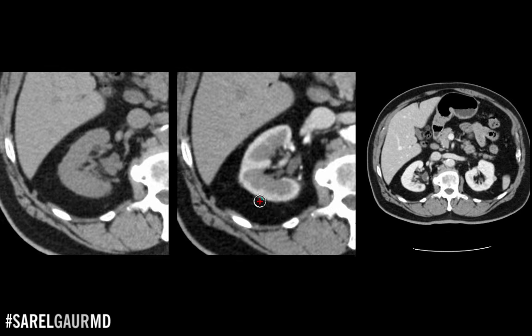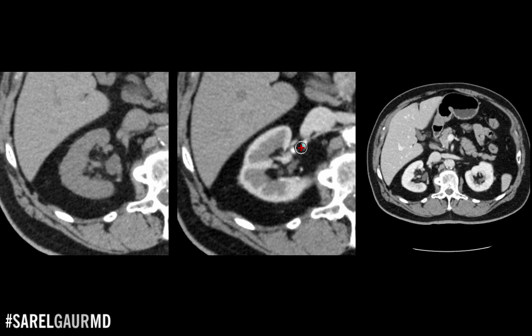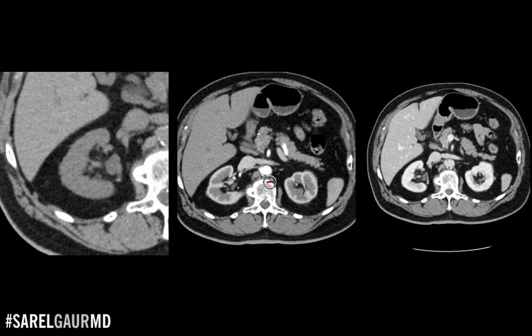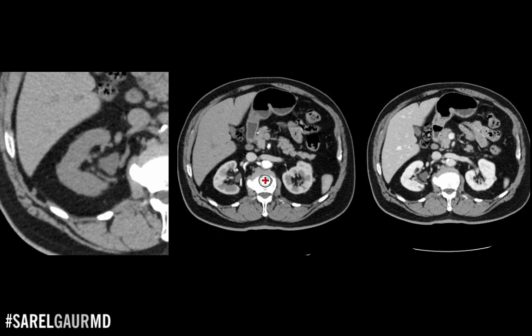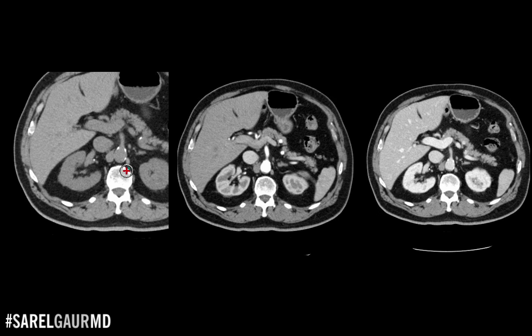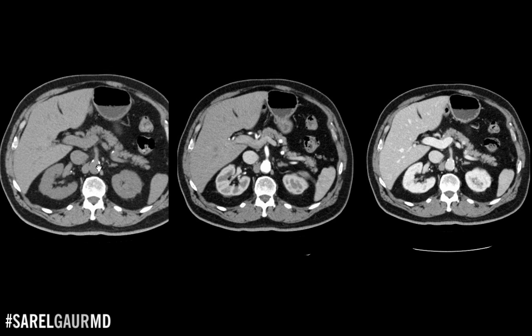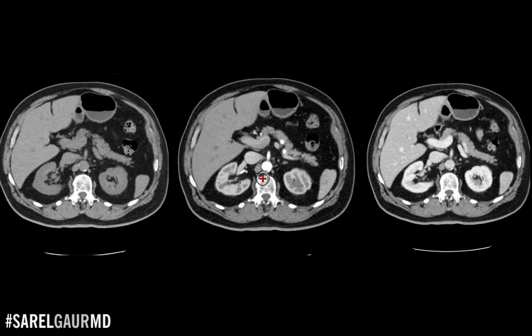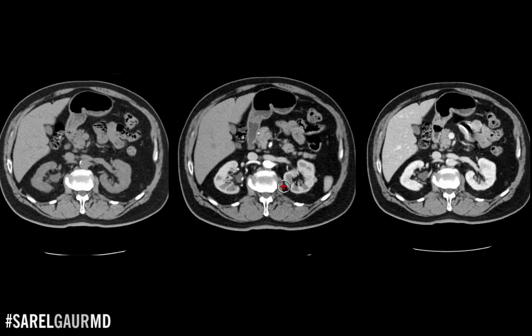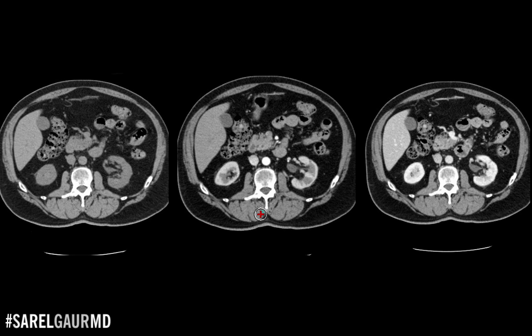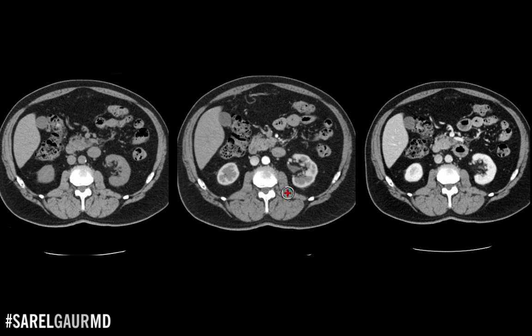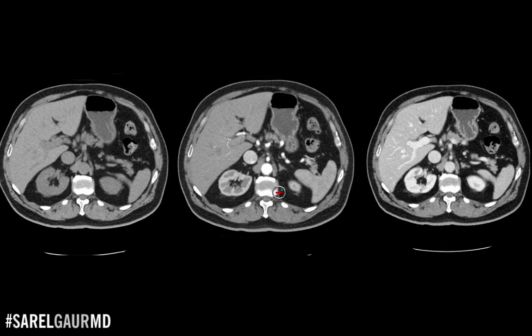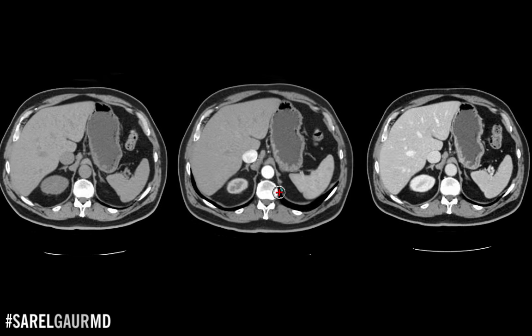To sum up: if I see a contrast-enhanced scan with heavy opacification of the arteries and a corticomedullary phase enhancement of the kidney, I can be fairly certain this is an early phase or arterial phase CT scan with IV contrast, performed about 20 seconds after the administration of contrast.